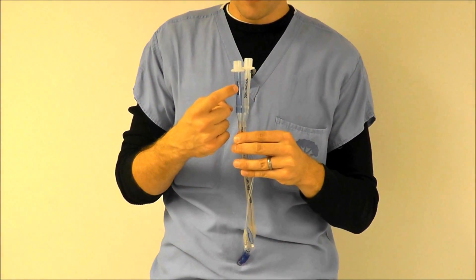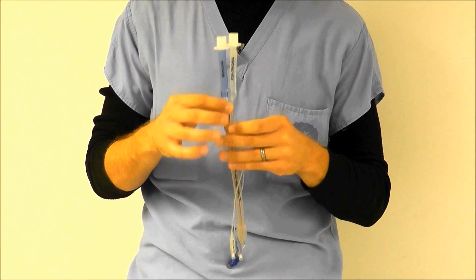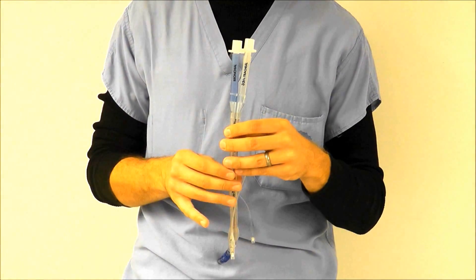It has two ventilation lumens — one lumen for the left lung and one lumen for the right lung. So let's check out a diagram to better understand how this works.